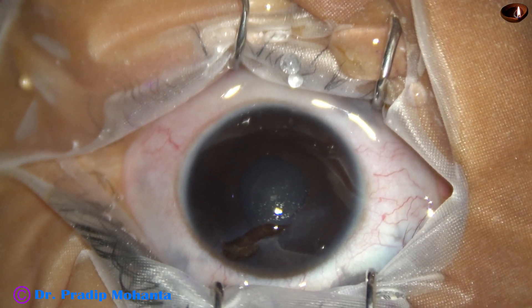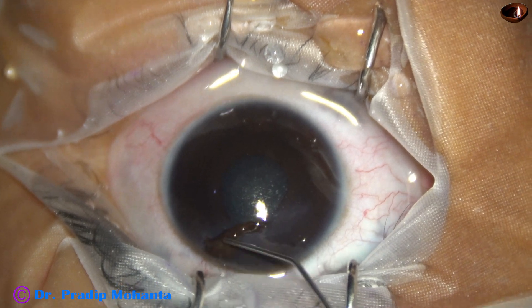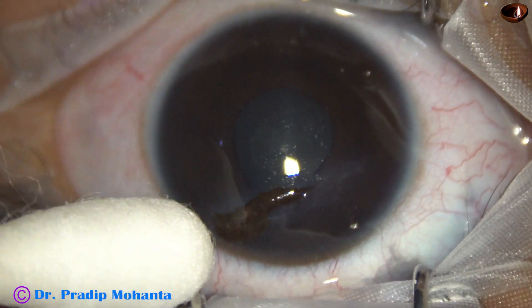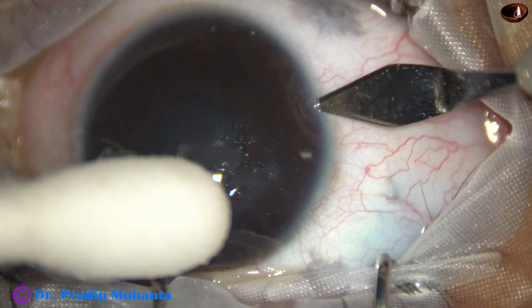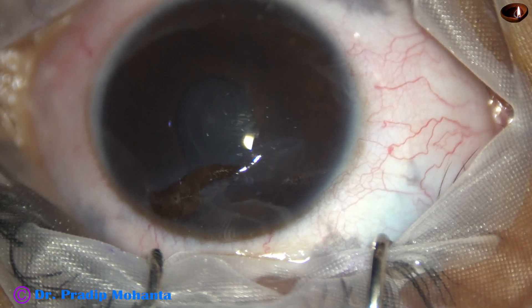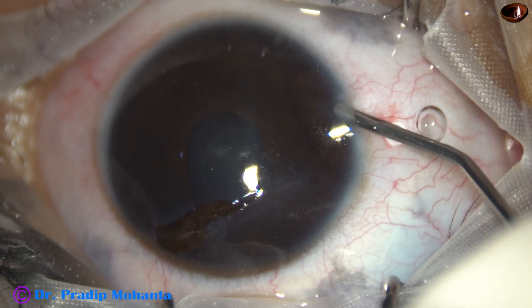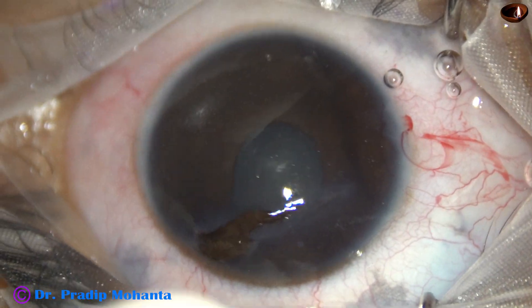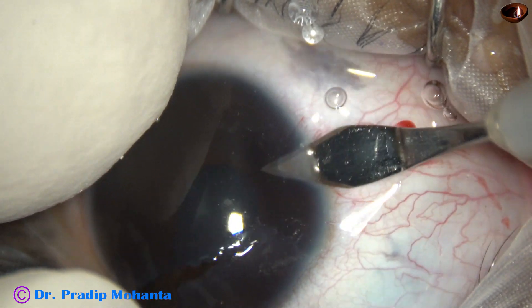The ocular surface is thoroughly irrigated with BSS. This is moxifloxacin. The iris that has prolapsed through the corneal wound — it is wise not to reposition it back, because it is in contact with bacteria of the ocular surface. If we do not abscise the iris, it is going to take all those bacteria inside the anterior chamber.